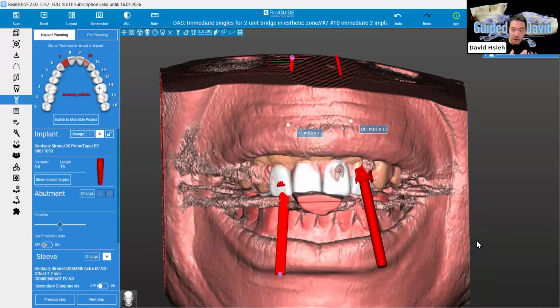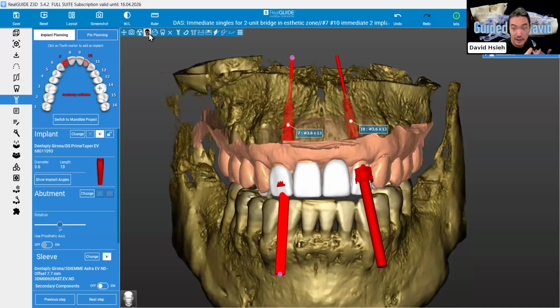So that's the power of treatment planning, right? Based on what you have, what you are facing, you can try to figure out if there's any alternative, try to make things better, right? So that's the benefit: plan everything beforehand, right?